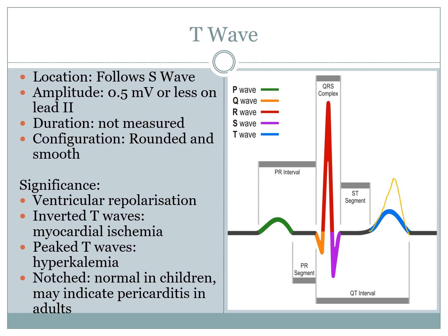You can have other things like peaked T's, so you can actually have really high pointed T's, and that usually happens when we have too much potassium. So remember, it's the potassium that's being drawn back into the cells during this phase. If we have too much, then we're still going to have that higher amplitude of pickup, which makes the actual T's look peaked.